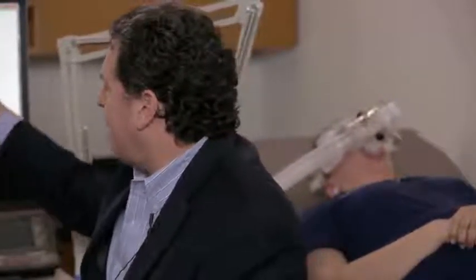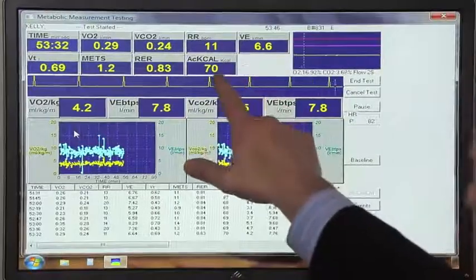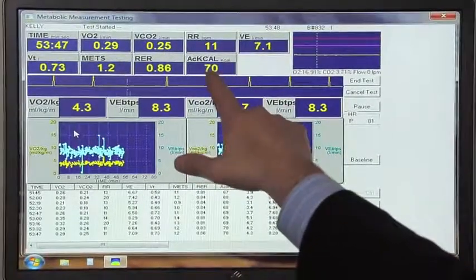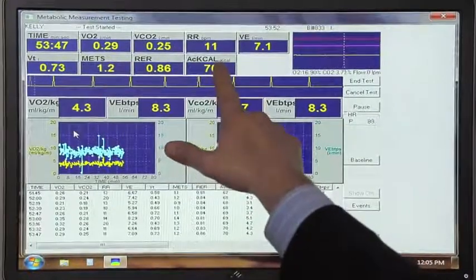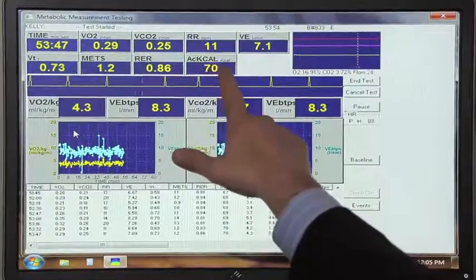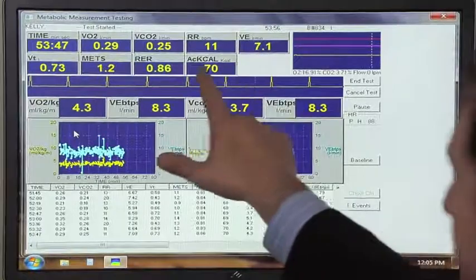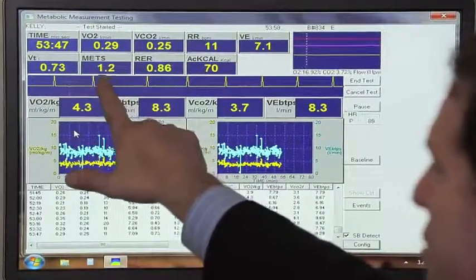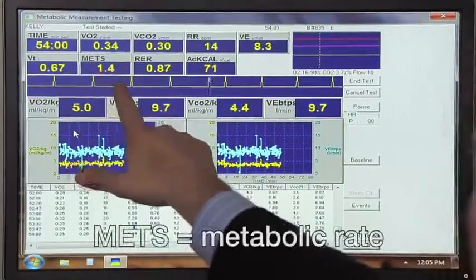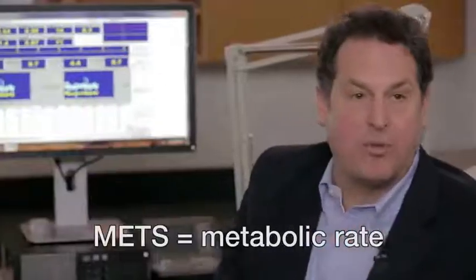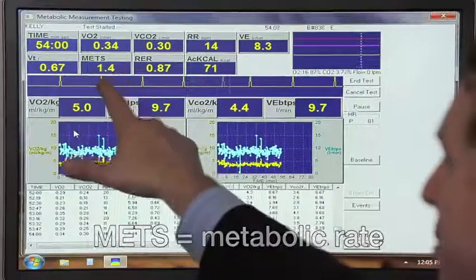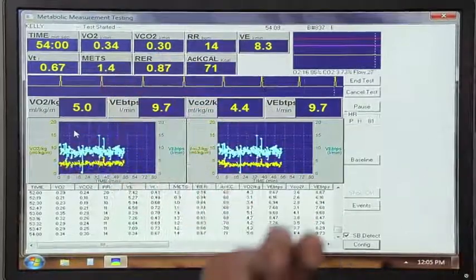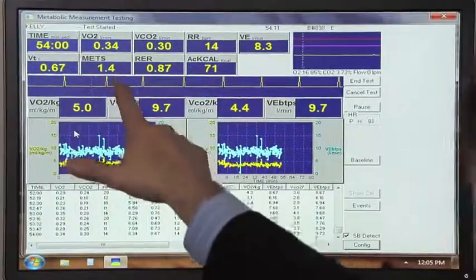Since we started this test, Stephanie has consumed just resting 70 calories of total energy expenditure, and that represents her metabolic rate, which is abbreviated as METS. One MET represents a resting metabolic rate, and you can see she's very close to being what we would classically define as rest at 1.4 METS.